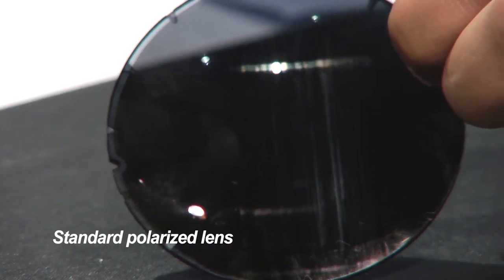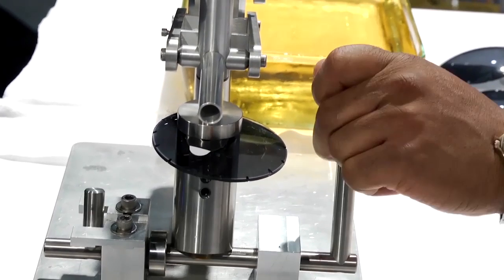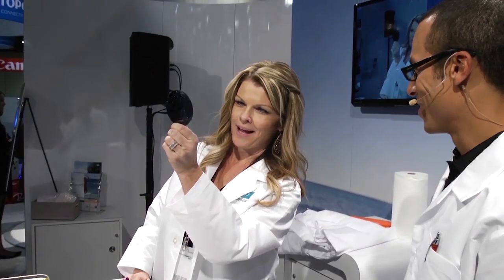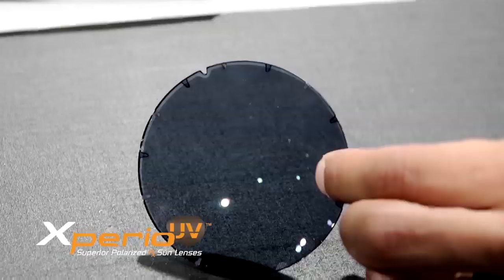Now we're going to take all that weight — 6.6 pounds — and put it down here. We did 17 passes with extremely abrasive steel wool. What do you think? Wow. There's no scratches, she says. Crystal clear.